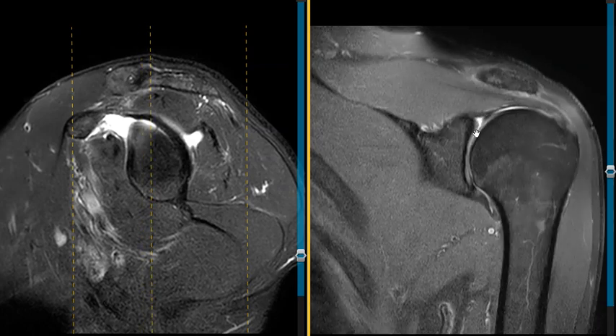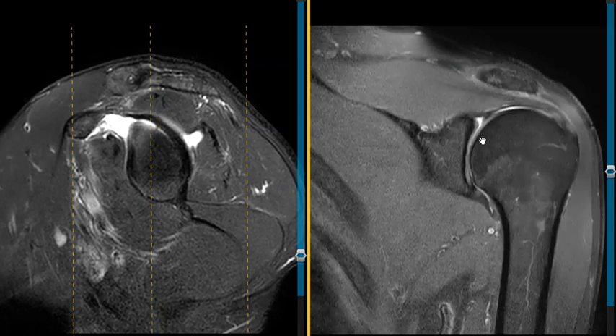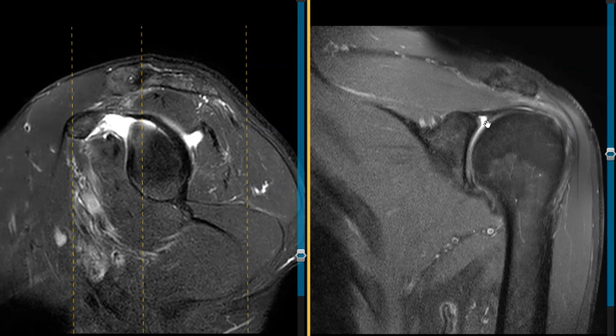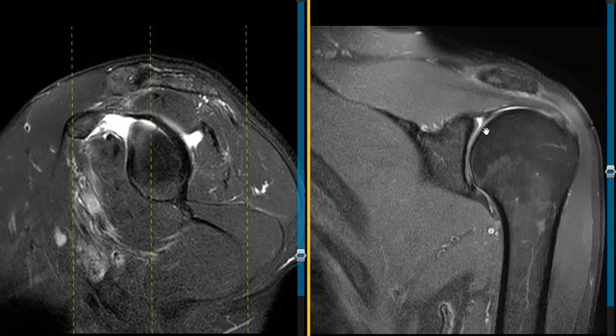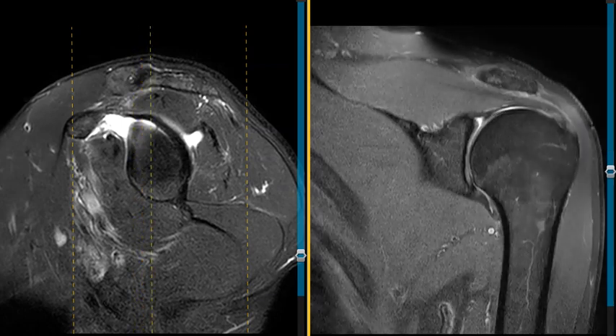This is a tear of the superior labrum in this patient and it's uplifted. This looks like a fairly well-defined tear — it's not complex. The surgeons like to know: is it a complex tear? Are they going to get in there and see something very irregular that they need to remove, or is it more of a simple tear where they can go in and possibly sew it back down? This one is not frayed or that complex, but it is uplifted.